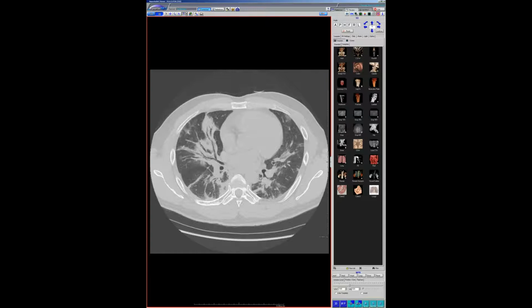And I think that gets into the third category, which is features that haven't been classically described, like lobar consolidation and nodules. I'm curious what David has to say on that, since he's seen so many and he's seeing the sicker patients. Are you starting to see some of those other features that we typically see in patients with bacterial pneumonia or other pneumonias that hadn't been described in these earlier series?